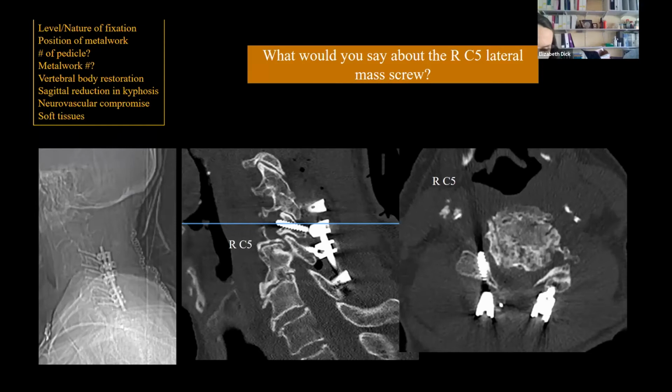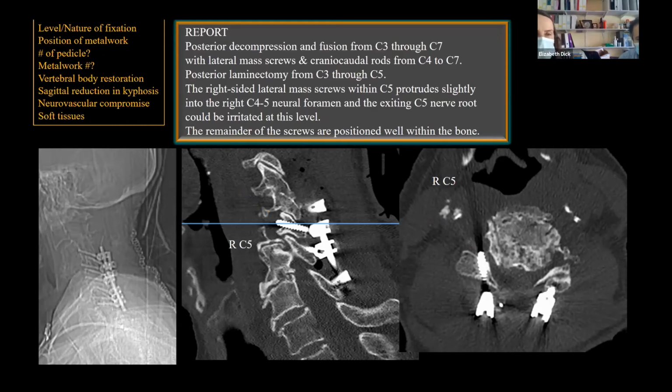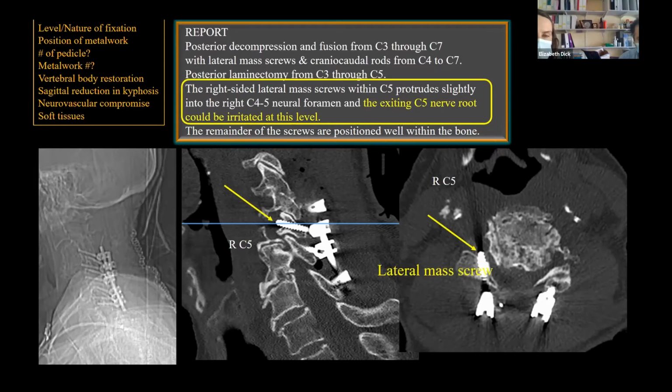Yeah, so we know, don't we, obviously, that the neural foramen at this level is the one with the C5 nerve root. So already I think clinically we're suspicious that there might be some irritation. And so actually what we're seeing here is that the screw tip is a little bit too anterior and protruding into the neural foramen here. So I think the way that we worded our report was we said that the right-sided lateral mass screws in C5 protrude slightly, and so the exiting C5 nerve root could be irritated.